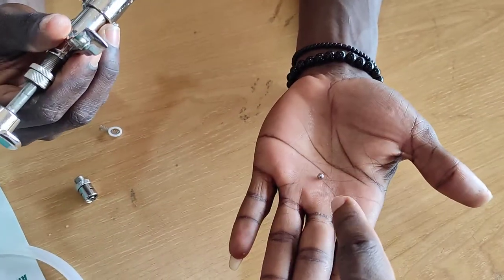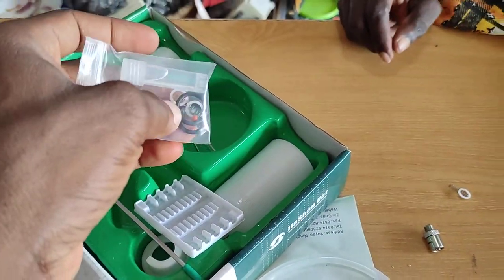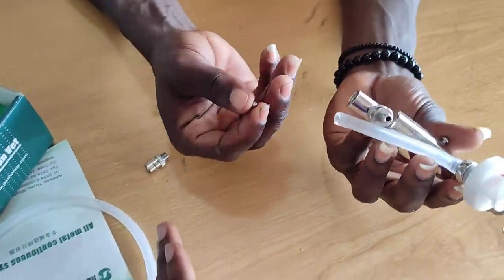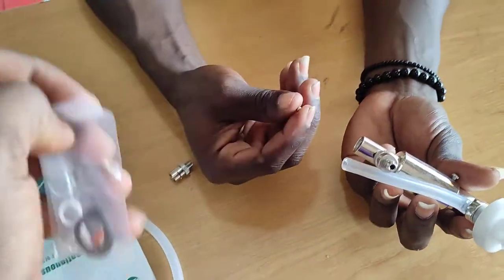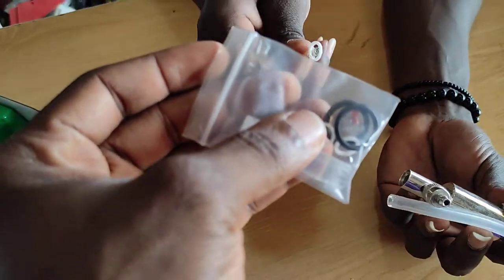This is how the ball looks like, and that's the spare. We suspect he mistakenly opened it and the ball fell and he didn't notice it. So when you lose your ball, you just take a spare one. If it's a spring you lost, you just take the spare spring.